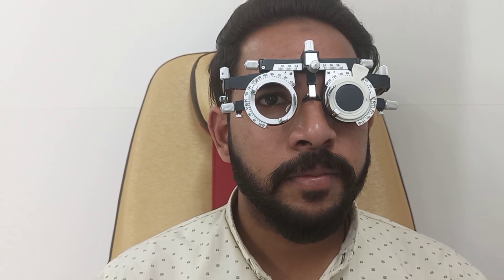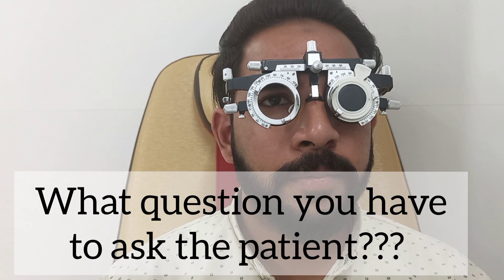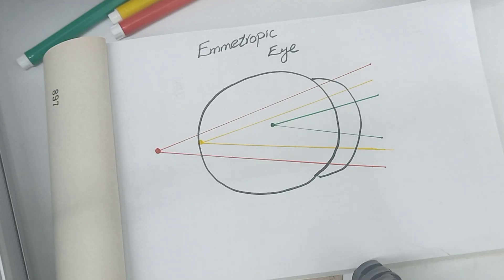We ask the patient: can you see the letters and numbers on the red and green background? Patient says yes. Now tell me — are the numbers and letters on the green background clearer, darker, and sharper, or on the red background? The patient responds: both equally clear. That's the expected result for an emmetropic eye, and we will now learn the reason.